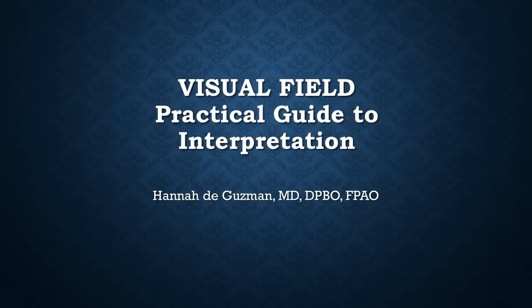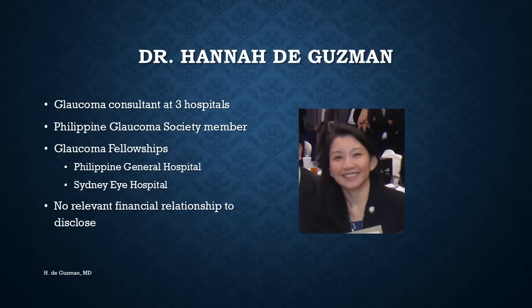Hi, I'm Dr. Hannah de Guzman, and I'll be talking about interpretation of visual field test results, specifically standard automated perimetry. I'm a glaucoma specialist and I have no relevant financial disclosures.